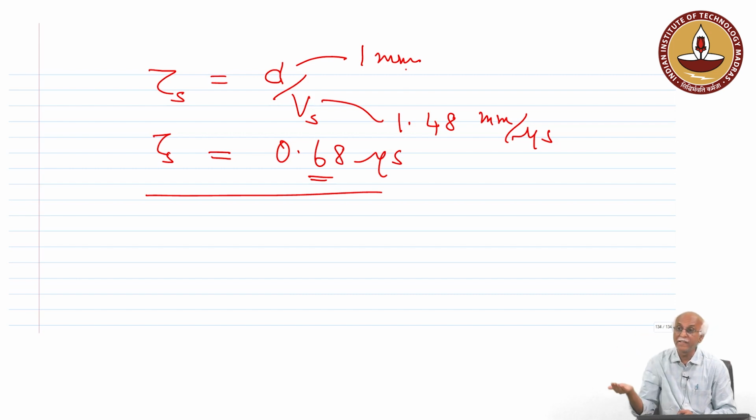If we know the intensity and we know the absorption coefficient, it will tell us how much power is being absorbed. We will assume that no diffusion is taking place. It is a short pulse, a 5 to 6 nanosecond pulse width, and within that period of time the heat is not getting diffused in the tissue, let us assume.